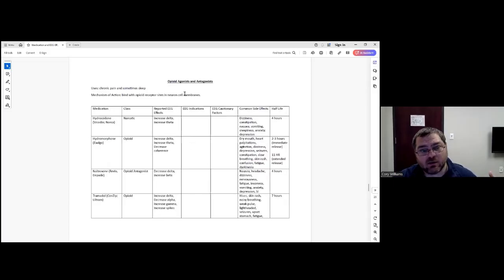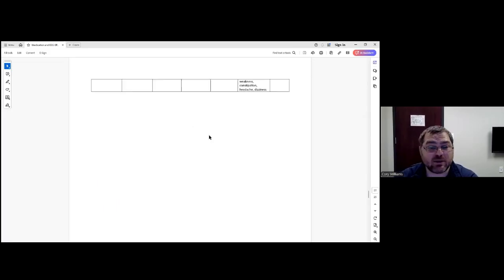Then we did include a section for opioid agonists and antagonists, excuse me. We don't prescribe opioids in our clinic. You may see people who come in on opioids, especially if you deal with a lot of chronic pain clients, or if you work in a substance abuse population. So it's useful when you're trying to analyze the EEG to figure out if you're looking at drug or medication effects, but I don't know that we would recommend them based on an EEG per se.